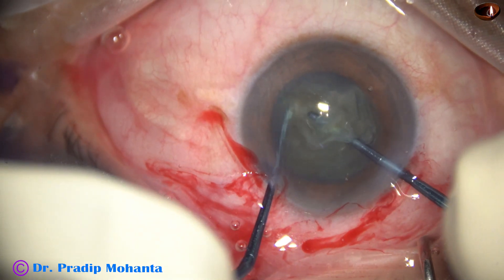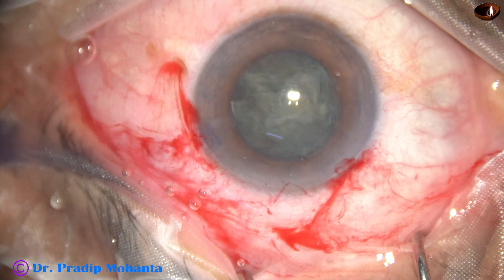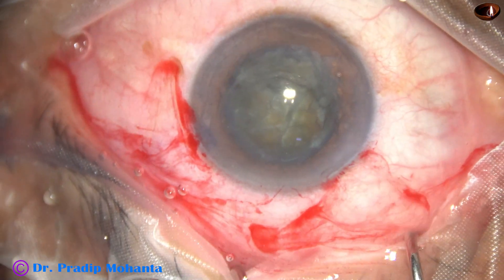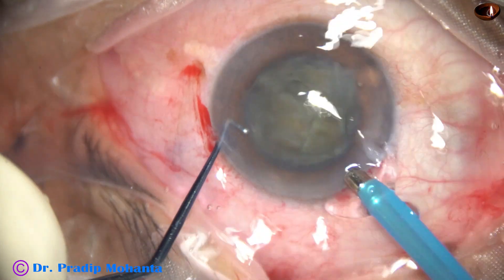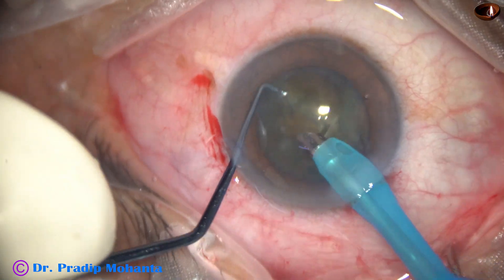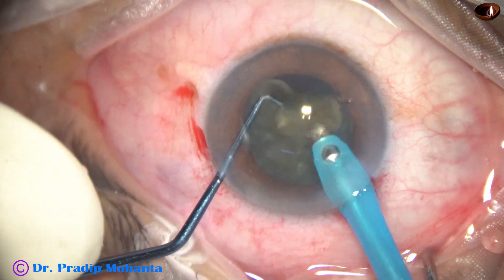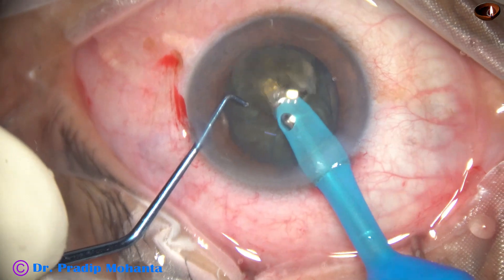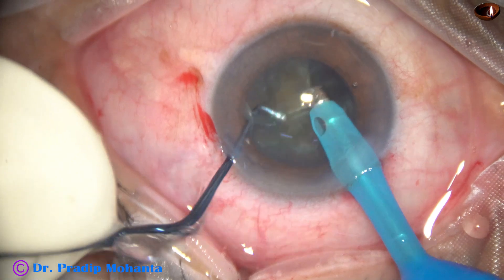Then one hemi nucleus is subdivided into two pieces, visco again, and then the phaco needle goes in. This piece is picked up and emulsified; the pieces are brought to the central part of the anterior chamber and emulsified.